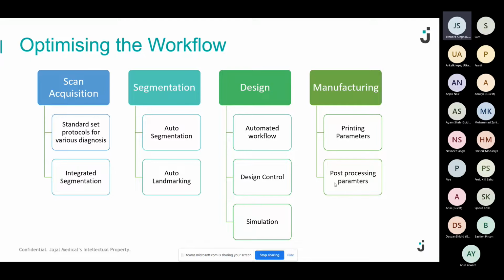Another example is integrated segmentation. Most of these scanners nowadays, from GE, Philips, or even Siemens, are such that the 2D scans could give you an actual STL converted model. Previously, it was merely volume rendered images that we could see. But now, they've incorporated this Technology 4.0, where they've got .stl files to be exported directly.